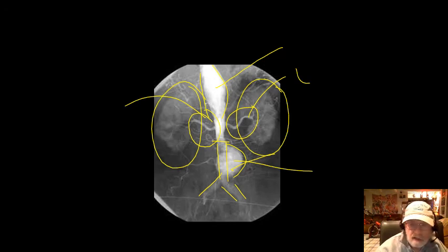They actually started to do things with minimal type surgery, where they go inside with a catheter and fix it. This one right here, they actually have to stop the blood supply, everything below, to be able to fix it. So that becomes a significant problem. But that's just another abdominal aortic aneurysm or two.